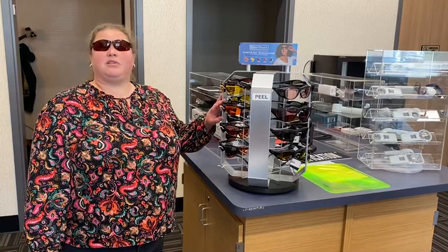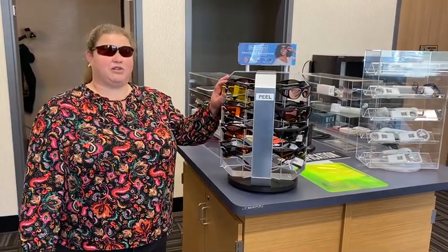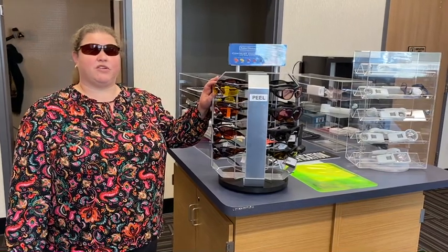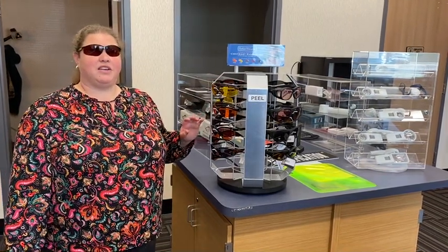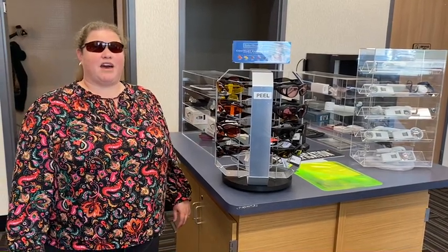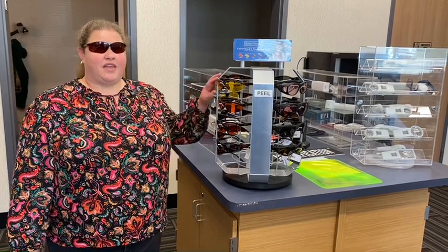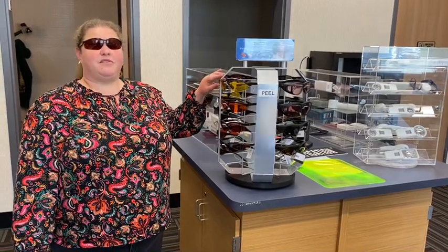There are a couple of different fits and types. The first kind I have the display turned to is the Solar Comfort, which is what I am wearing. These will fit directly onto your face and are intended to wear without other types of eyewear.